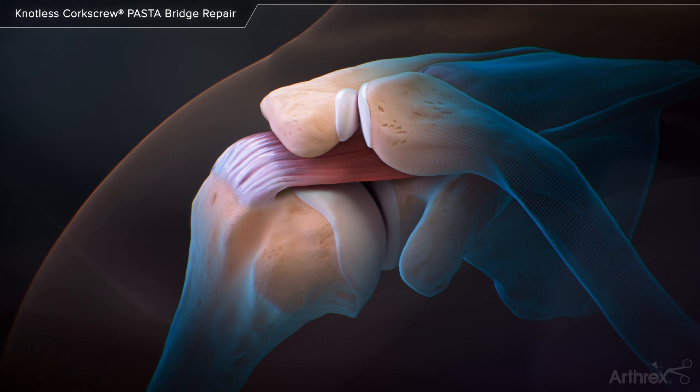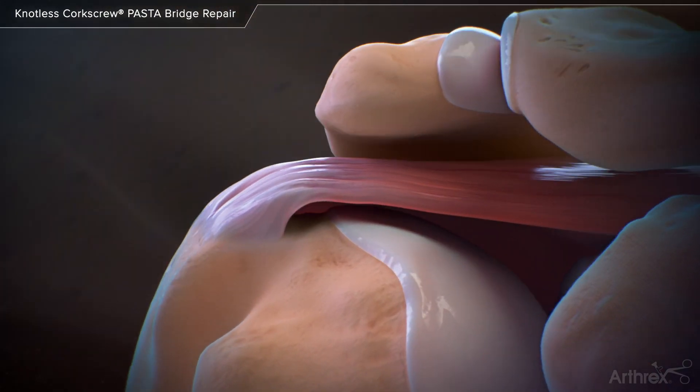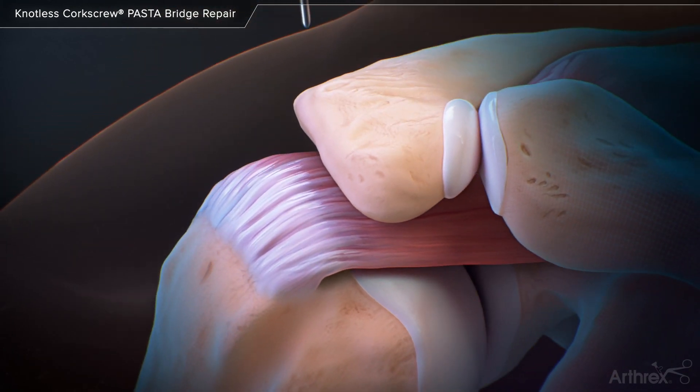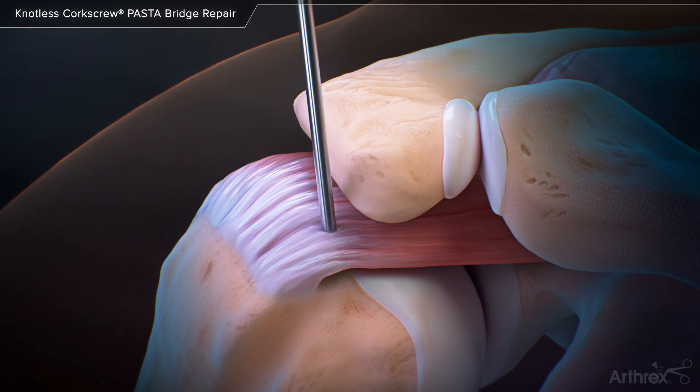The pasta bridge uses double row fixation with one lateral and two medial row anchors inserted with a trans-tendon repair. A spinal needle is used to locate the necessary trajectory and position of the first anchor, just off the lateral edge of the acromion. The anchor position is prepared through a system of steps to percutaneously dilate the soft tissue to allow for the insertion guide to easily pass through the tendon.